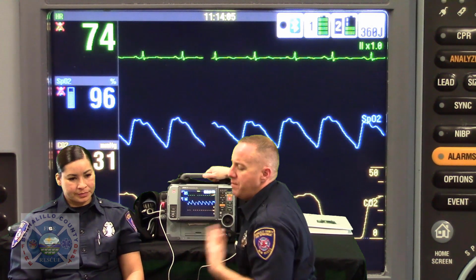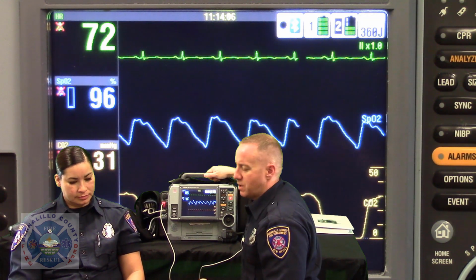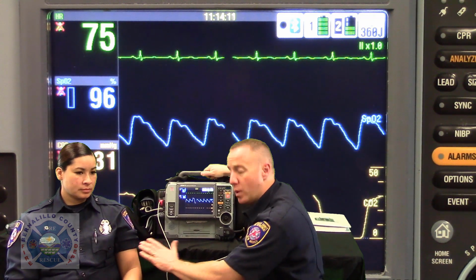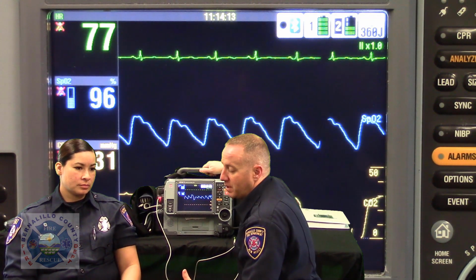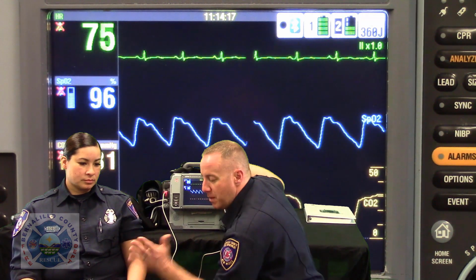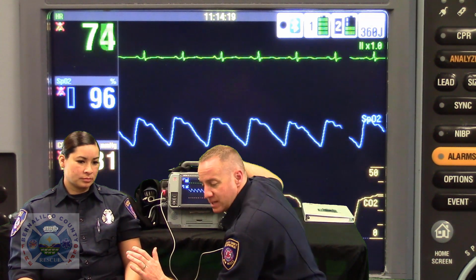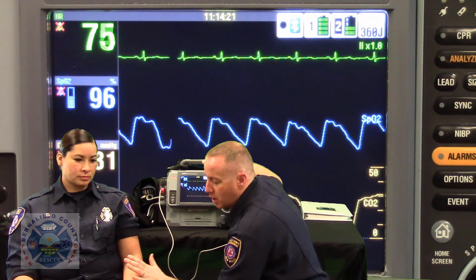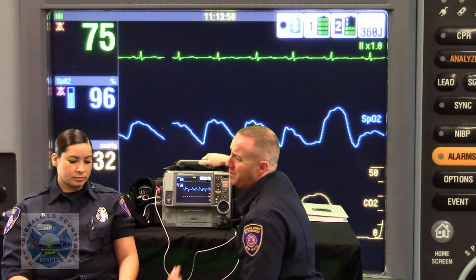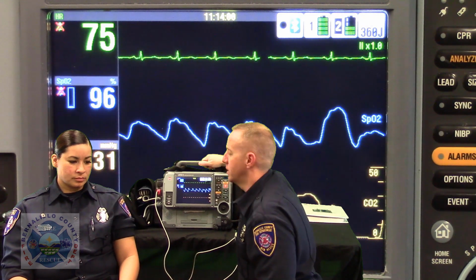Now, I'm the person checking vital signs, so it would be in my best interest to stay with the patient, explain to the patient what I'm doing, coaching them as, if you could hold still, keep your movement to a limit, maybe have a hand on the patient, say, I'm going to be here with you, we want to make sure we get a good assessment and that everything we check is accurate, and most people respond to that by cooperating with the clinical assessment.